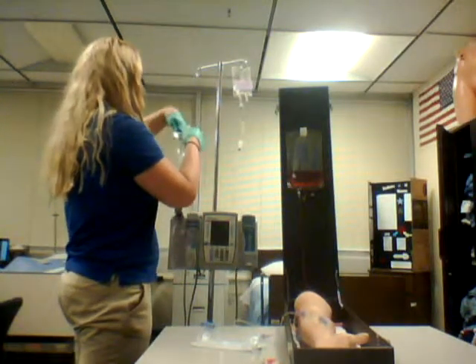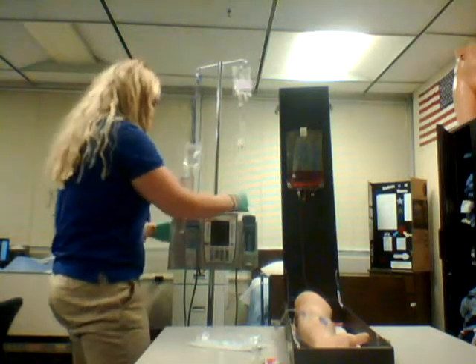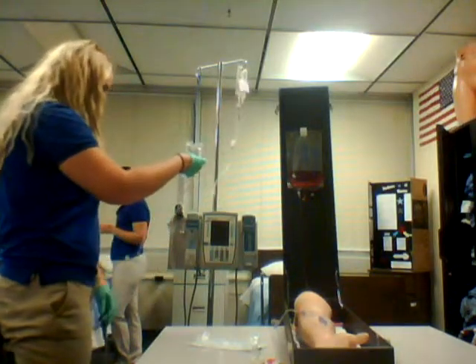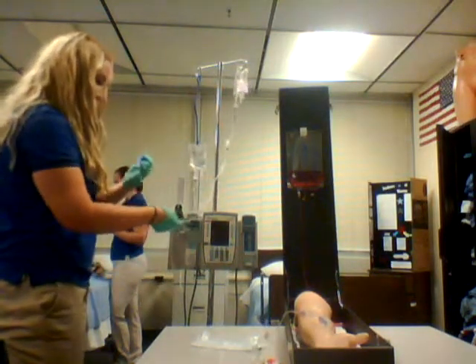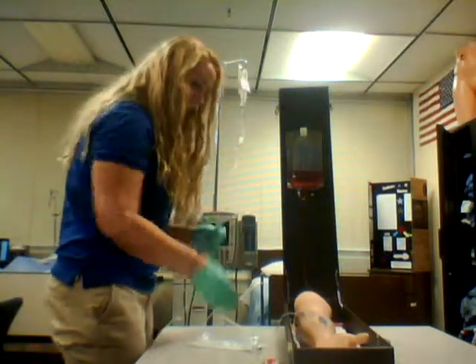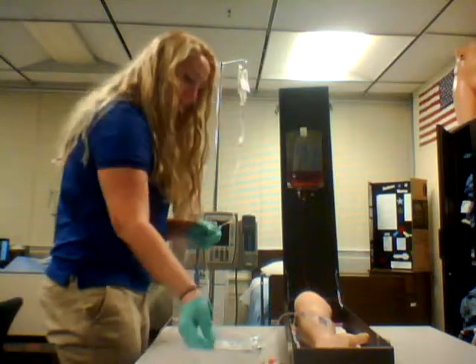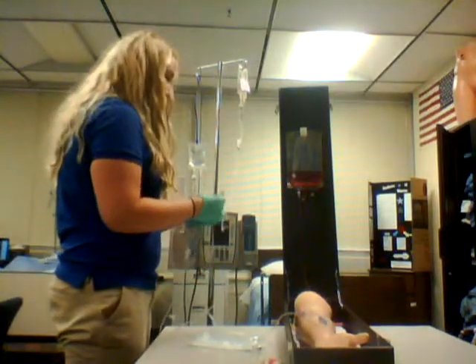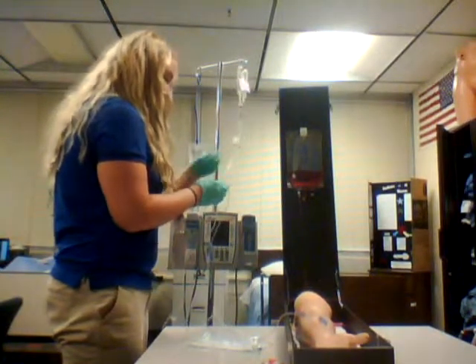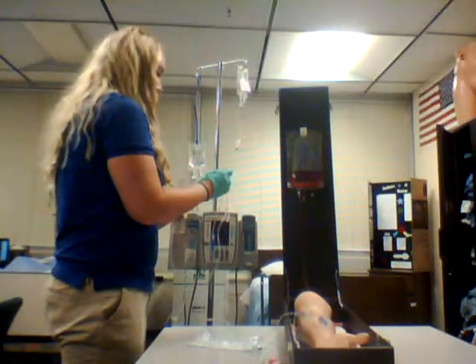Since this tubing just came out of its package, I know that it's sterile and I still have this protected. So one of the nice things about this is I'm not having to do flushing because I know this is already done. And I will connect the piggyback tubing.